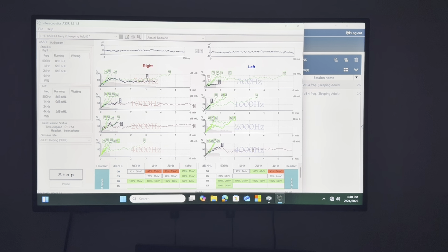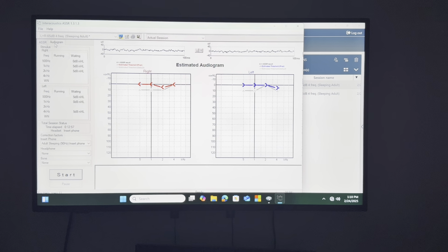So now we'll go to bone conduction. So you can stop it. For your lab, if you go on the audiogram tab there, you're comparing the ASSR threshold with the behavioral threshold, not the corrected one. There, if you see AAA, that's the ASSR threshold. That threshold you're comparing with the behavioral threshold.